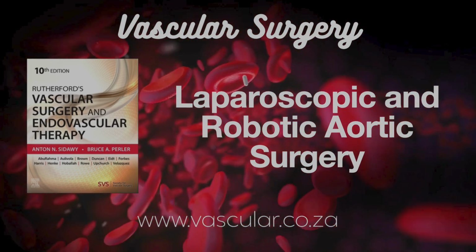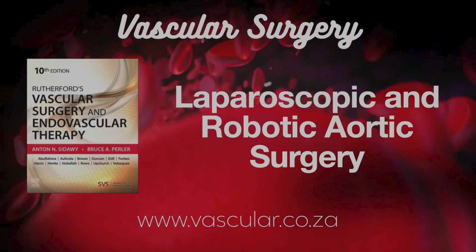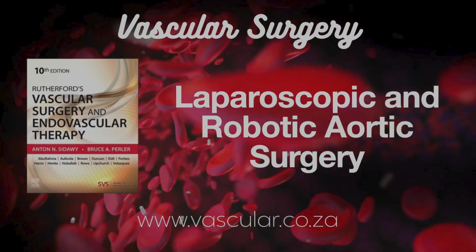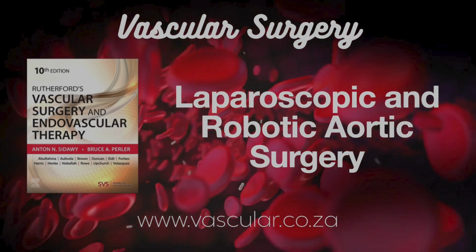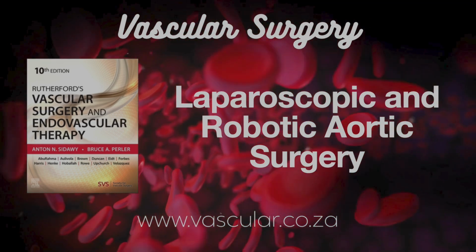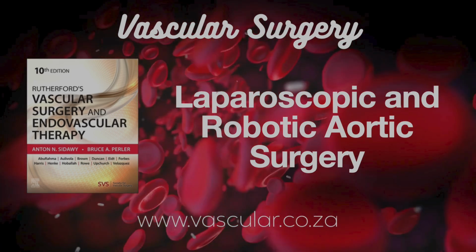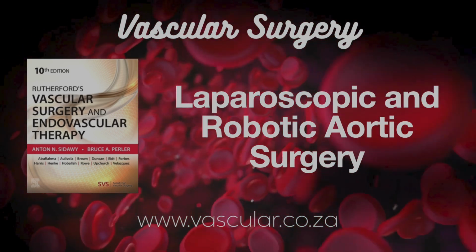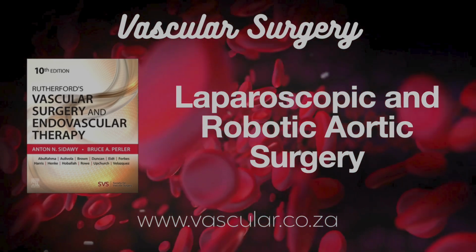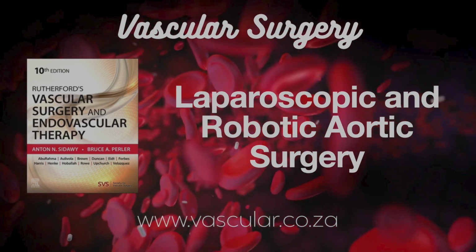Absolutely. Well, that was incredibly thorough, a real deep dive into laparoscopic and robotic aortic surgery. It seems the takeaway is these are valuable, less invasive tools for the right patient in the right hands. But they come with significant technical challenges, potentially longer procedures than open, and we're still waiting for definitive proof of superiority in many situations. And endovascular is often still the first minimally invasive choice. That sums it up well. There are important options when endo isn't feasible, but not necessarily a replacement across the board.